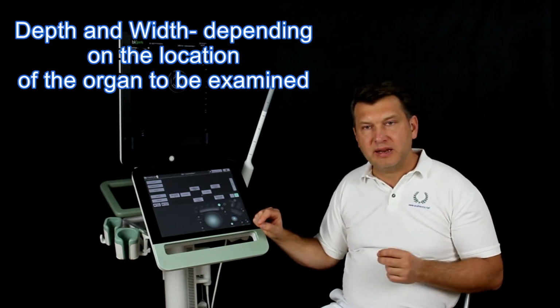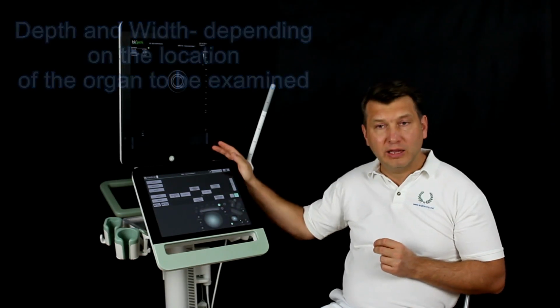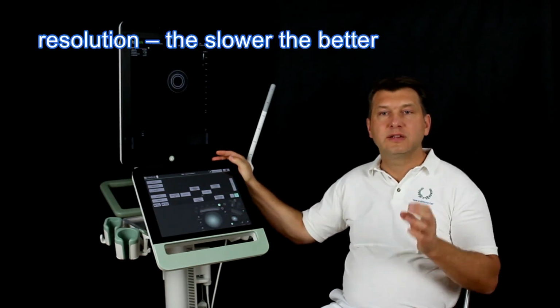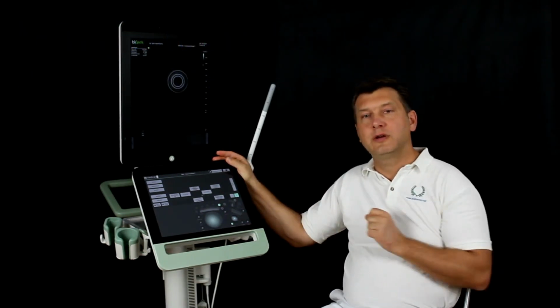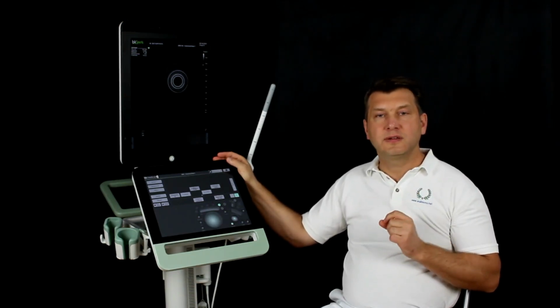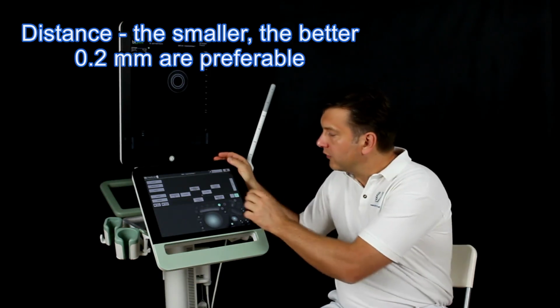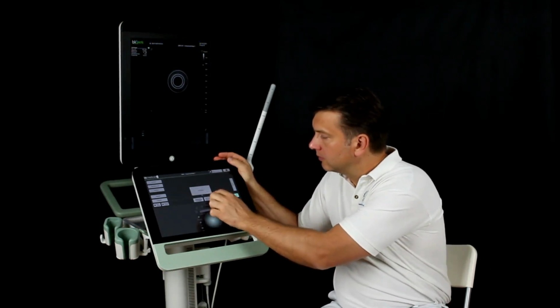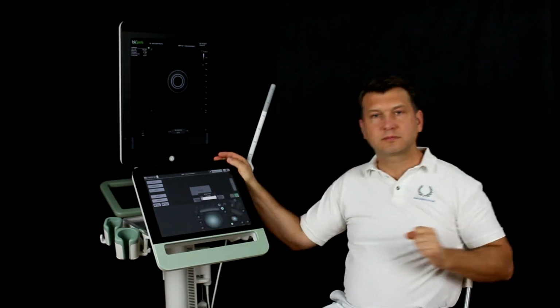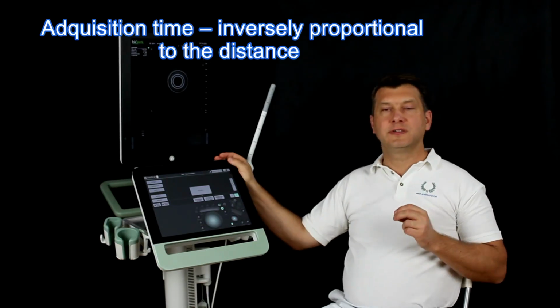Depth, depending on the location of the organ to be examined, and width as well. Resolution, the slower the better, in this scanner remains in standard position. Distance, the smaller the better, 0.2 millimeters are preferable. Acquisition time inversely proportional to the distance.